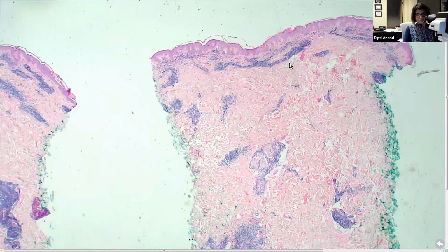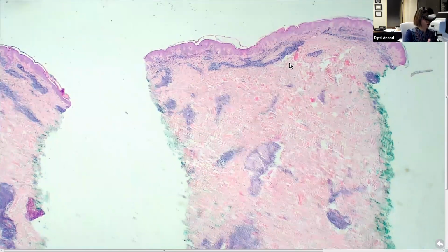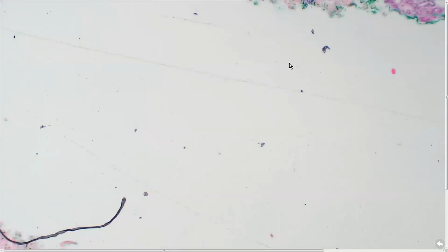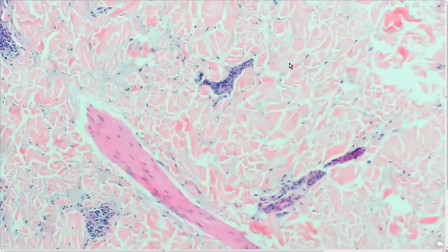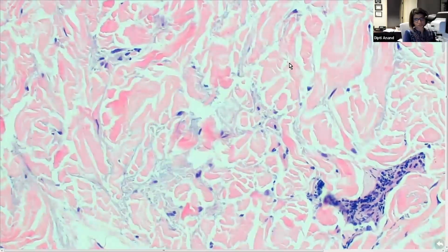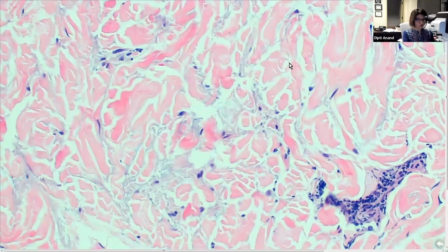So this is either tumid lupus or EAC, or one of the categories of gyrate erythema. So how do you make the distinction between the two? Well, for tumid lupus, you want to see some mucin, but that can be hard to see, right? And what is this? Mucin. So you are seeing mucin. So this is tumid lupus, but again, it's not your in-the-face mucin. It's the lymphocytic infiltrate which grabs your attention.